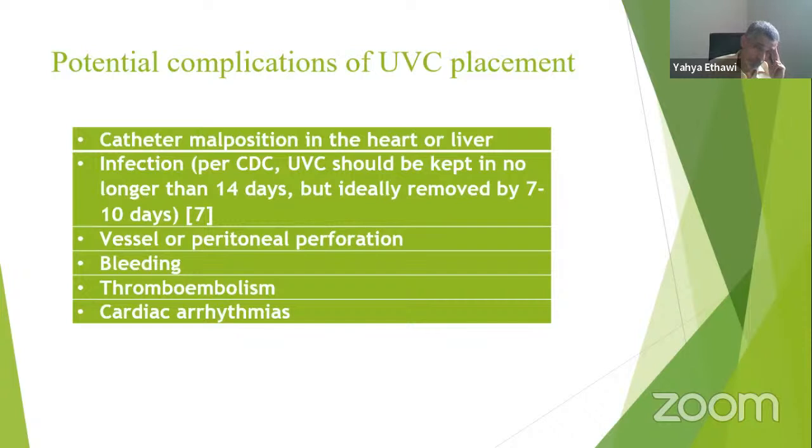It's always better to avoid, and therefore the UVC should always be at the level of the diaphragm and away from the liver. If it's in the heart, it can cause movement and turbulence of flow and can cause thrombosis and also may cause arrhythmia. Yeah, go ahead.